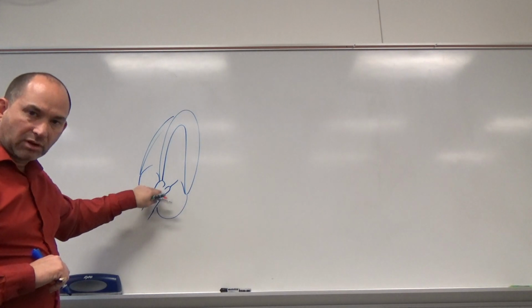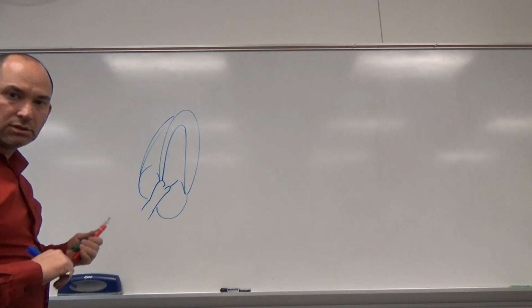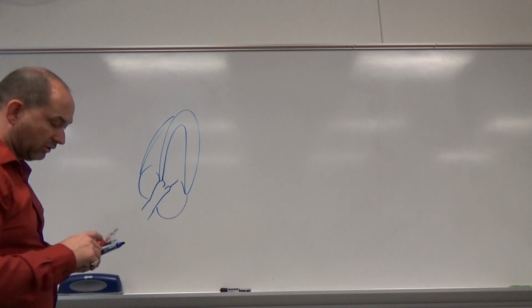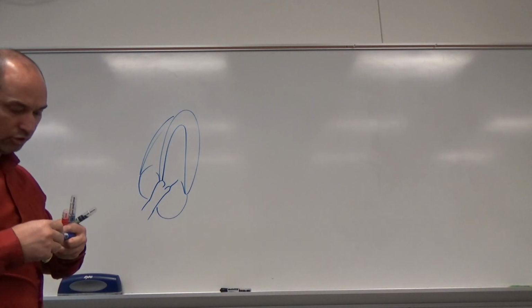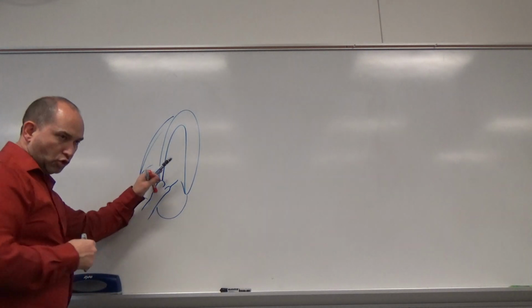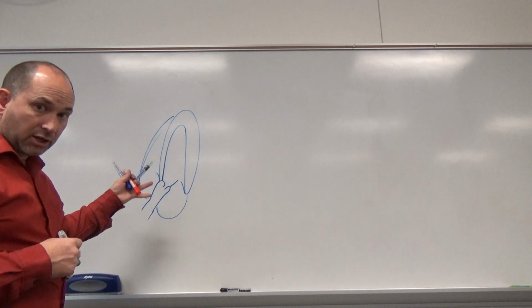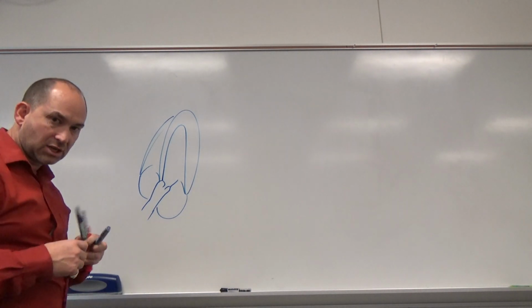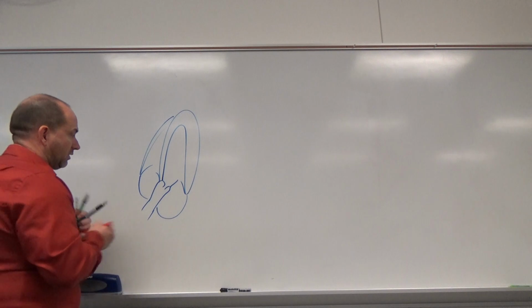I'm concerned about seeing the aorta open with the middle of the aortic valves, because this is where we do our Doppler to determine how blocked up it is. Once we got this view, we'll take a 2D clip of this, then we're going to take a color clip of it. You might even zoom on it. We're looking for regurgitations, which would come back in red in this case.